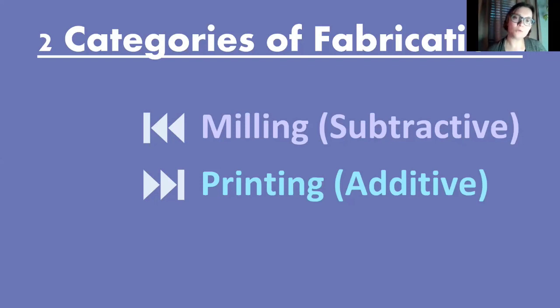With milling, or subtractive manufacturing, it's subtractive because you have a puck of something and then you grind out whatever you're trying to create. Many of you may have seen a CEREC machine where you have the puck and then you mill the crown out of it. There are bigger mills like the 5-axis and 7-axis mills where you have a hockey puck that goes into the unit. It's called a puck of material. It looks like a hockey puck. With dentures, that puck is made of polymethyl methacrylate, or PMMA.